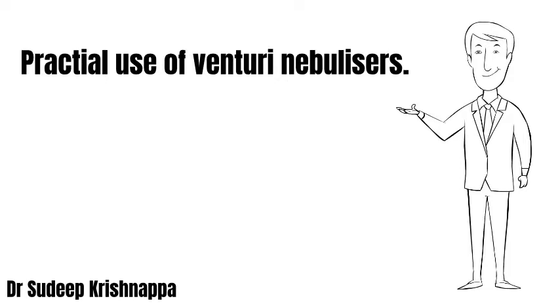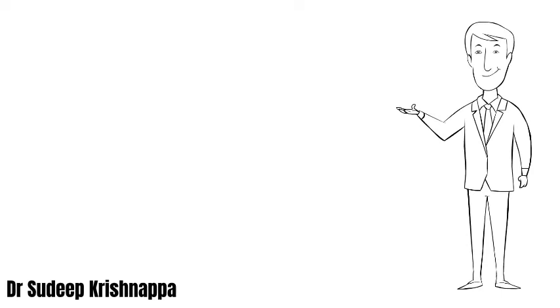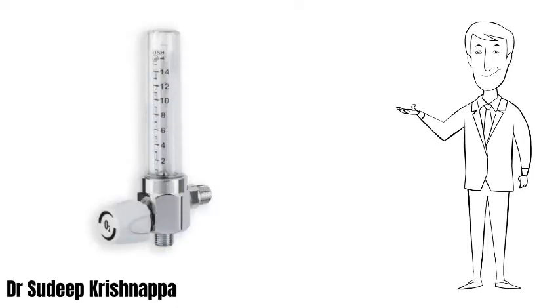So the first problem you are likely to face is when you use an oxygen flow meter rather than a compressed air device. When you use the oxygen flow meter, next time try keeping the flow below 5 liters and see whether this is able to generate aerosols or not. I'm sure you'll find it will not. As you increase the flow gradually, you'll start seeing that the aerosolization starts and you'll start getting good mist. Once you reach about 8 to 10 liters, you will find appropriate functioning of the device.